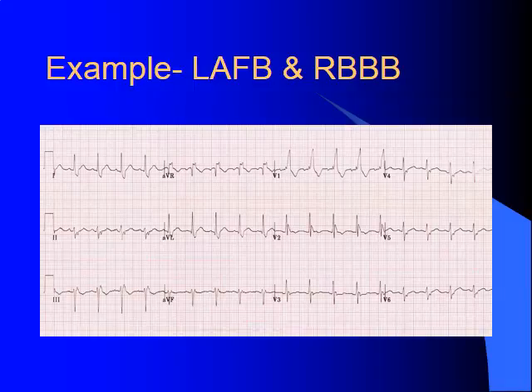You guys remember we talked about the complete heart blocks when we were talking about our degrees of heart block in the AV node a couple lectures ago. When we have complete AV dissociation, this is what that's going to look like. We can't really discern between the two. The only difference is that the block is occurring lower, but still no stimuli are reaching the ventricles.